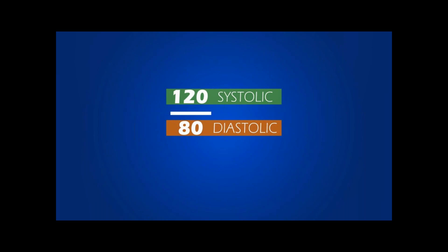If you ever had your blood pressure taken, you likely noticed that the results were stated as one number over the other number, such as 120 over 80. The number on top, in this case 120, represents systolic pressure, and the bottom number, in this case 80, represents the diastolic pressure. Let's take a close look at the dial used for determining such a measurement.